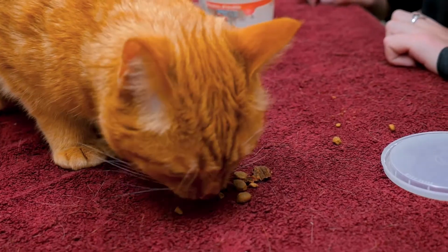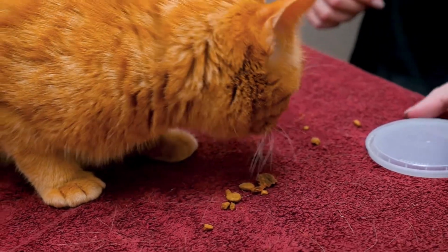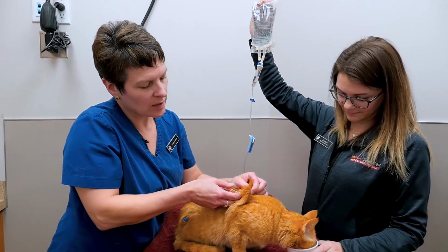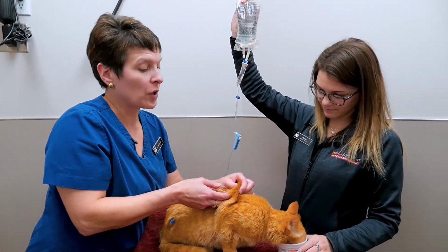One of the biggest things I think that makes it difficult for pets and people is the more stressed the people are, the more stress the cat is going to get. So if you set them up with some food and it's a low stress kind of thing for them to do, their tolerance is actually very good for this.